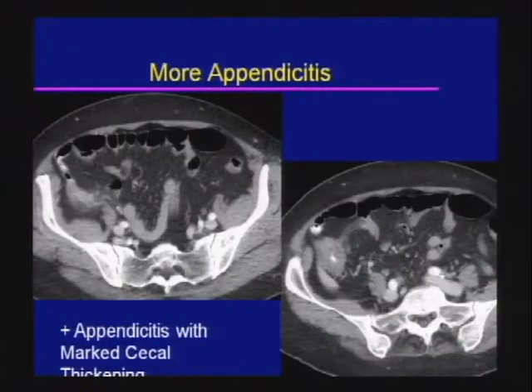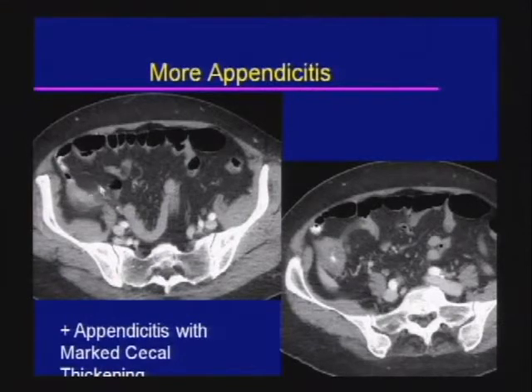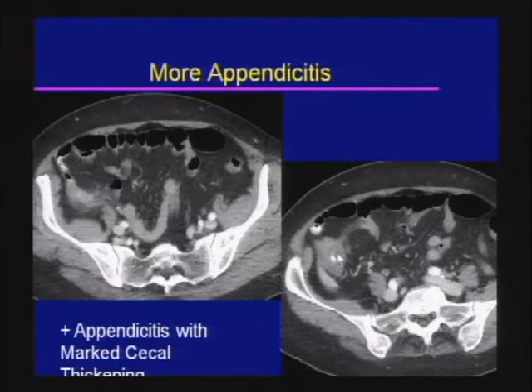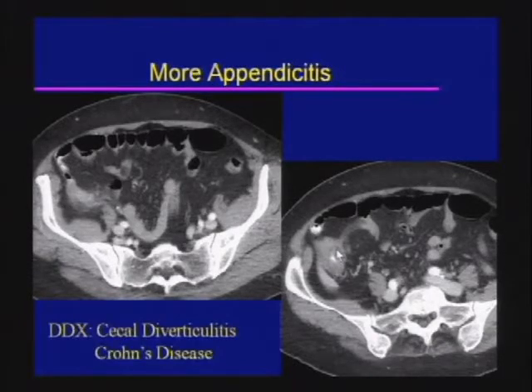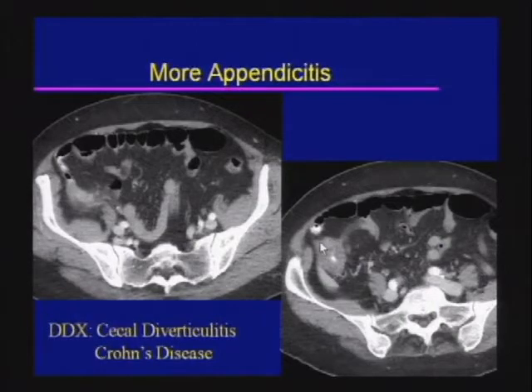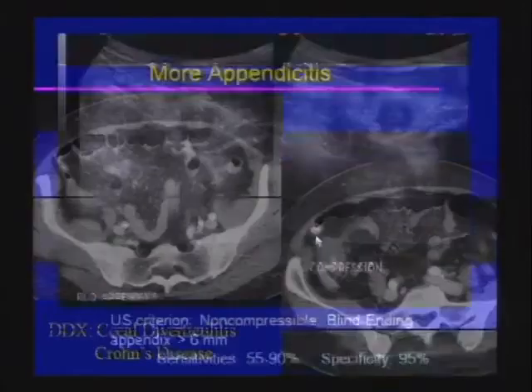A final case of appendicitis shows an abnormal, thickened appendix with peri-appendiceal stranding and marked cecal thickening. Don't shy away from the diagnosis of appendicitis if you have that much cecal thickening, but include several things in the differential, including cecal diverticulitis, Crohn's disease, and a rare underlying malignancy.